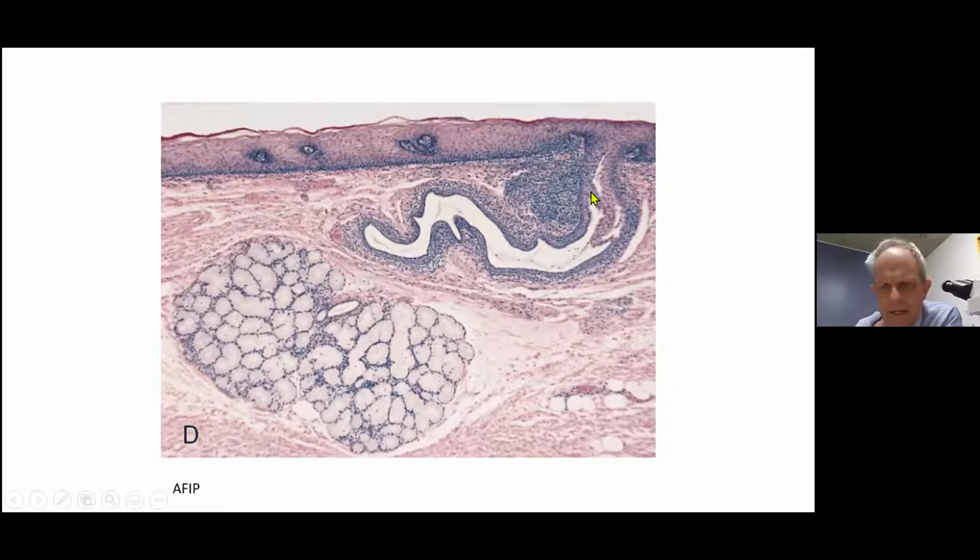And then here we've got a duct, which effectively leads into these mucus-secreting glands. Now, this is an unusual photograph, really, because it's not often we see this sort of histology in the normal esophagus, because these glands and ducts are fairly few and far between. But it does give you an idea as to what the normal histology looks like.